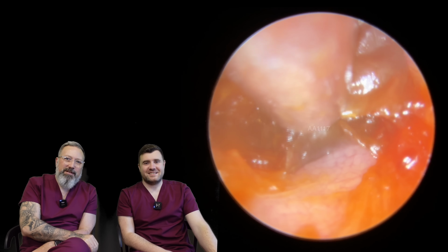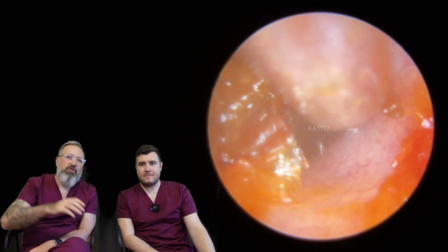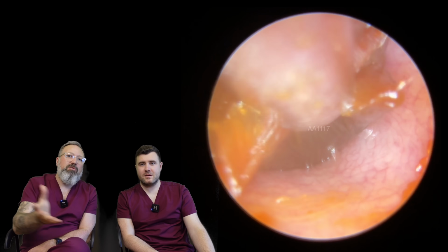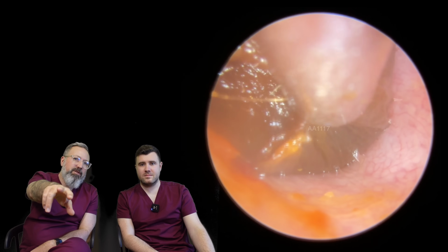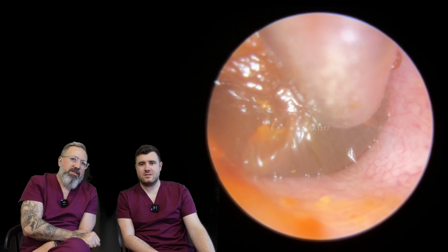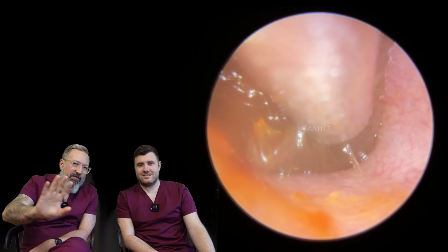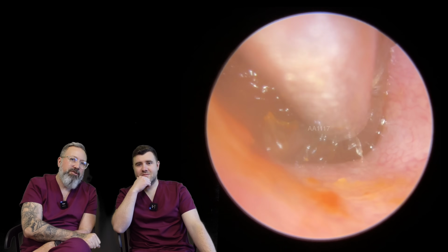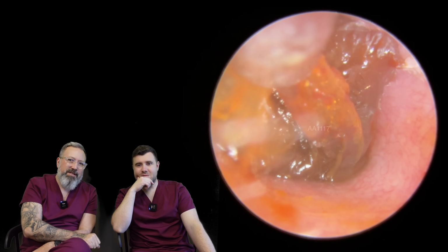So we're pulling this away now. There we go. Ooh, that's concertina. It's almost imploding into the suction tube as we go along, but it's these bigger flaps of skin now. We go left and right, and you can see lifting at the bottom. It's got that rippled effect at the bottom because there's a flap of skin lifted up in front of that bottom section. Oh, you can see it's coming. There you go. You can see that come away.